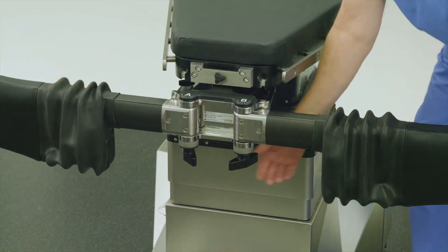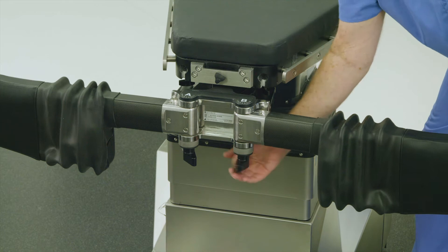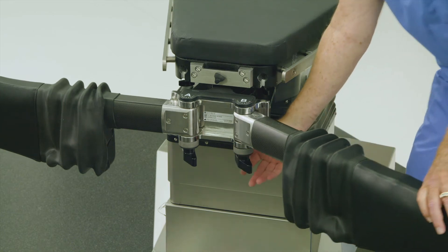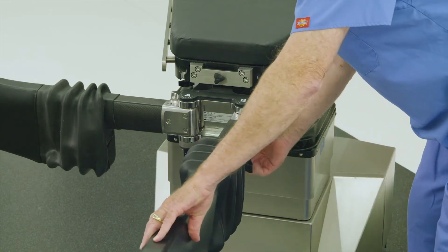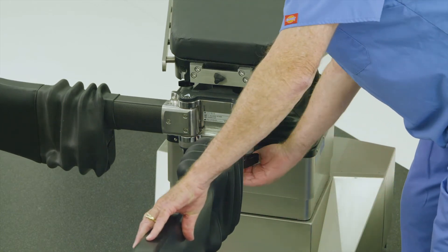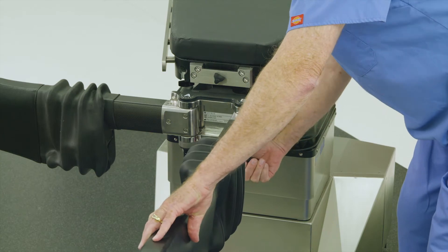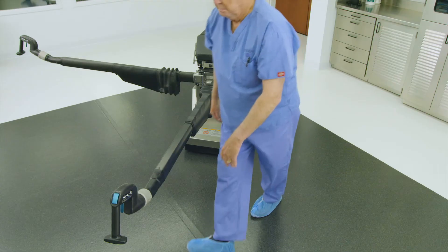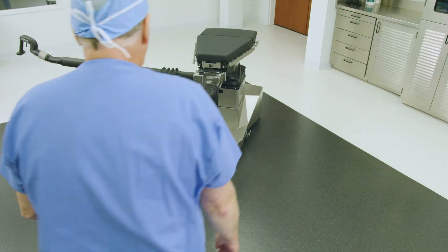Next, loosen the knob below the B rosette and set the B joint to position 4, then re-lock the B rosette handle. Adjust the patient's left leg abductor spar using the control handle shown here.